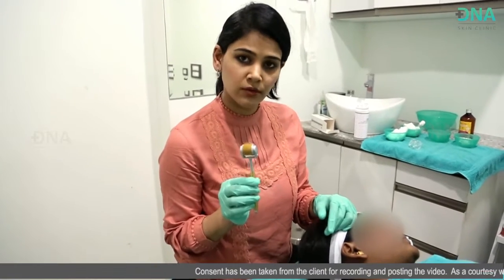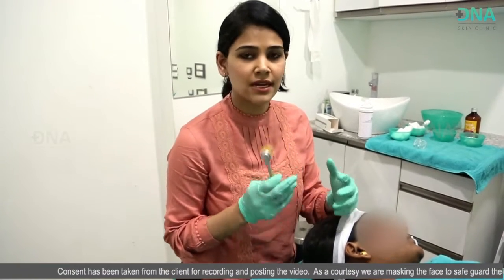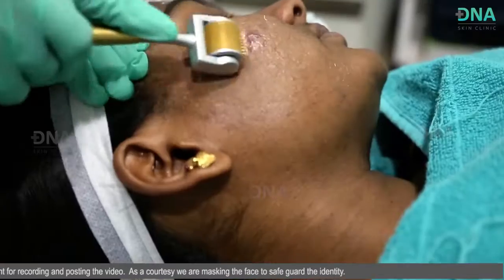This is a new Dermaroller we've just opened. Dermarollers usually come in very good sterile packing, but still, for people who are really particular about creating a sterile environment while doing these procedures, we have soaked the Dermaroller in an antiseptic solution for a couple of minutes and then rinsed it under cold running water.